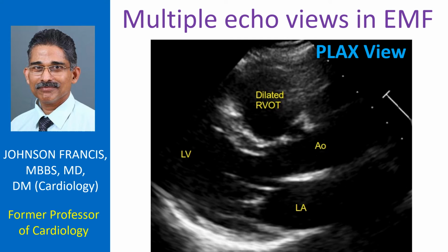Conditions with a dilated RVOT will have a characteristic clinical finding of RVOT pulsations along the left sternal border in the third left intercostal space. Pulsation is not associated with the heave in conditions like Ebstein's anomaly and right ventricular endomyocardial fibrosis, where the right ventricular pressures are not elevated.